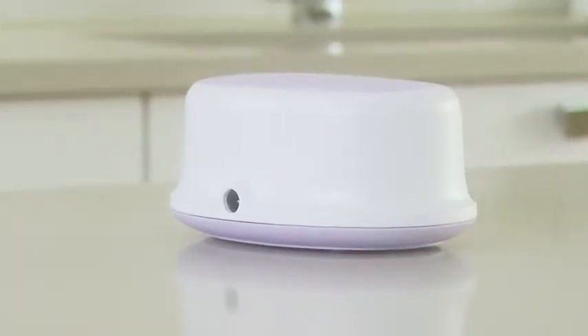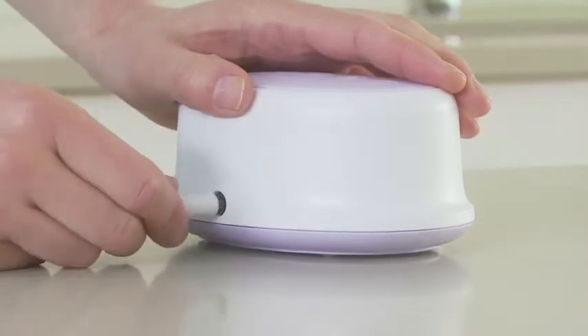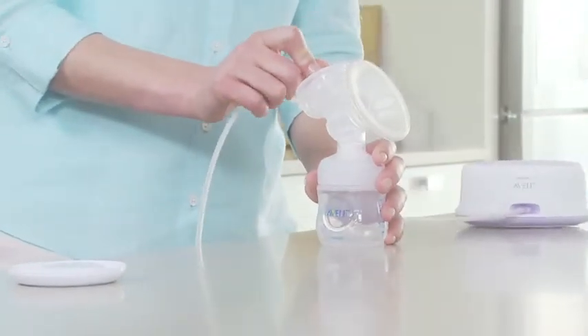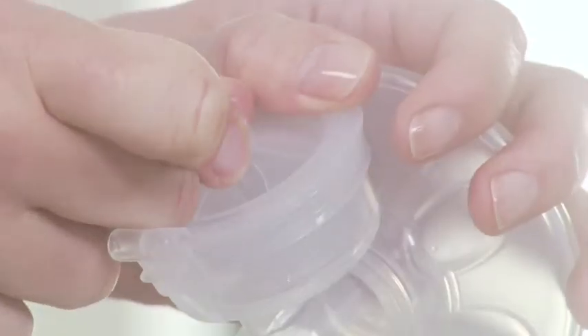Insert the adapter into the wall socket and insert the other end into the base unit. Attach the silicon tube and cap onto the diaphragm, and push the cap down until it is securely in place.